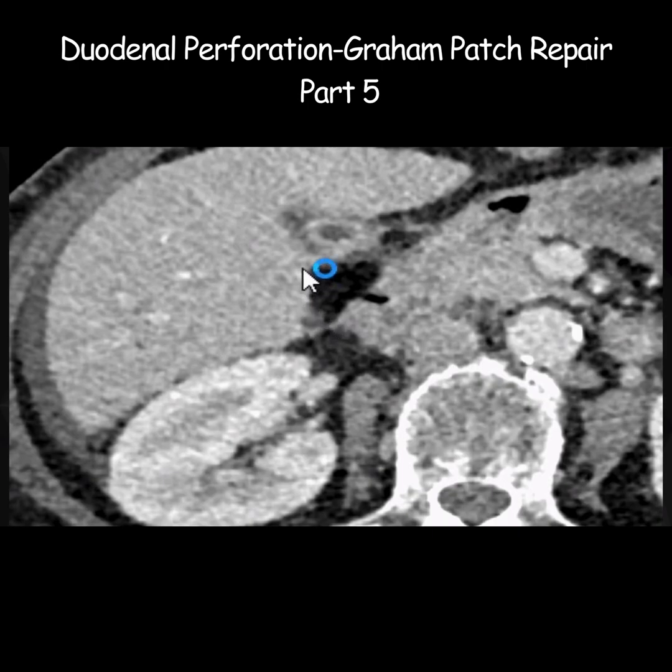Do you see a kind of triangular blob of fat just overlying the site of duodenal perforation? Well, this is the omental patch. So this defect now does not communicate with the peritoneal cavity because it has been sealed off by the omental patch. It is very nicely sealing the site of perforation — there is no further leakage. This appearance is the hallmark of a successful Graham patch repair.